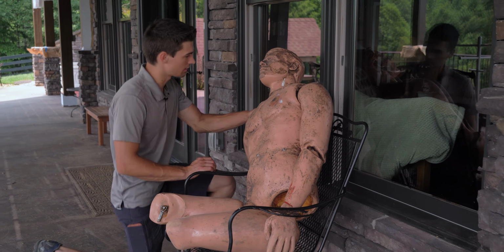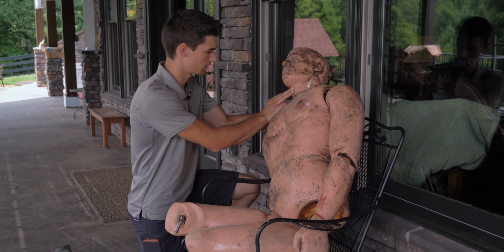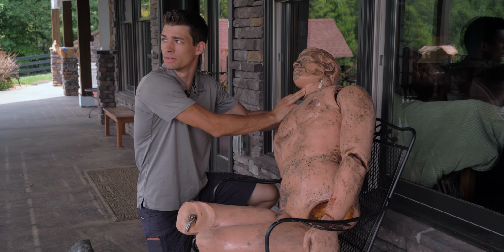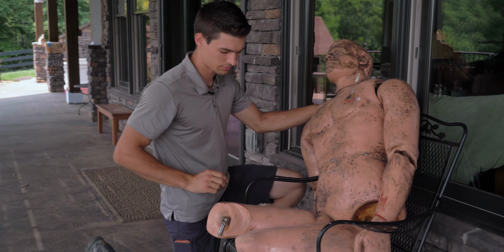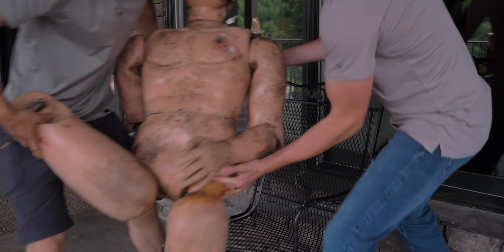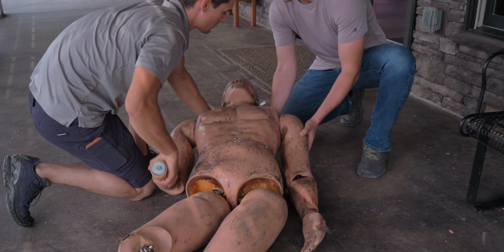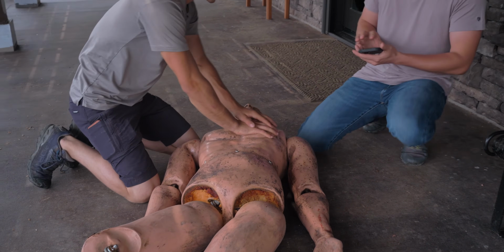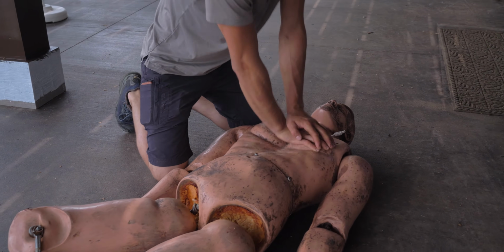Hey there. What are you doing? Hey. I don't think I'm feeling a pulse on this guy. Was he breathing? No, I don't think so. No? Can you help me get him out of the chair? Yeah. Just get him on the hard ground. I'm gonna start compressions. You gonna call 911? Yep. Get AED.